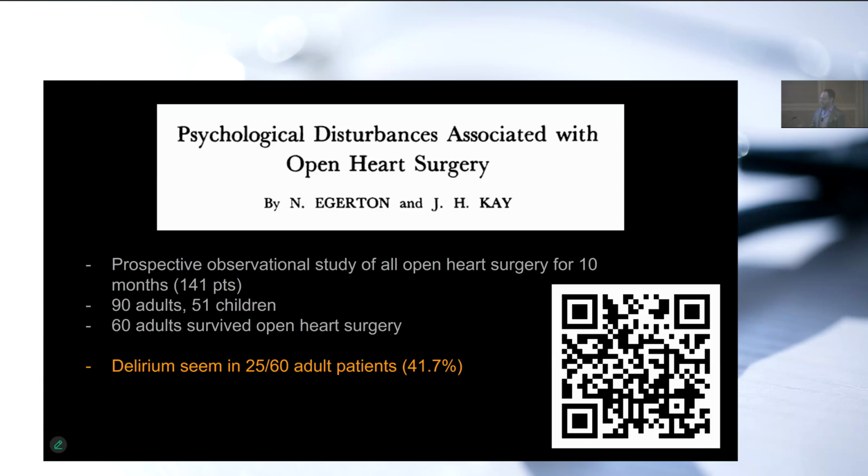So the question of delirium as an important topic after cardiac surgery was already discovered and identified in the 1950s. And it went on that way where it was a bit of a passing fascination. People reported over time that the delirium incidence was decreasing, but no one thought to say, well, can the EEG have something to say about this? I mean, could we predict this some other way, but on clinical grounds? And so the EEG fell out of favor over time, mainly because we got better and better at giving anesthetics. We got other monitors. We got saturation probes. We were able to sample gases and be able to tell, well, I'm giving this much anesthetic, and we know that this much anesthetic is associated with unconsciousness in most patients. And so the EEG kind of fell away as a useless tool.